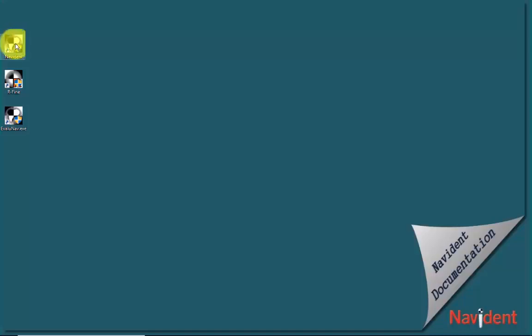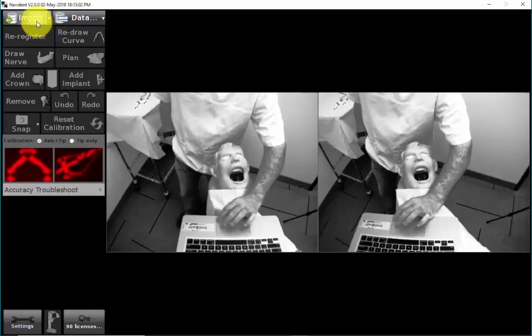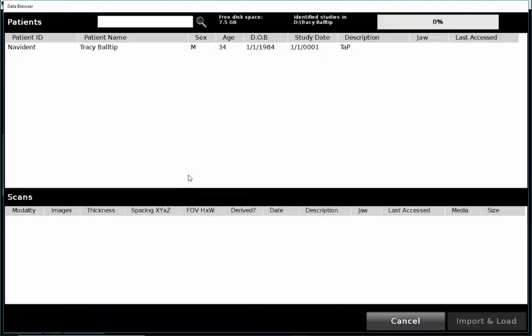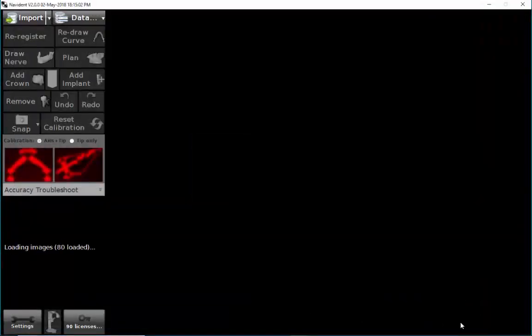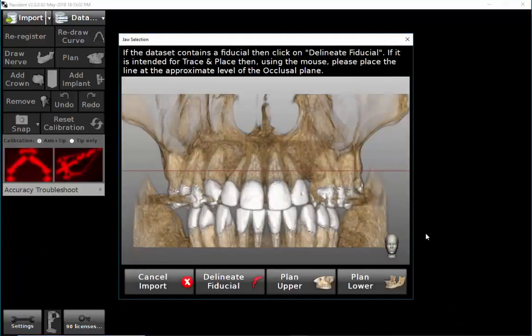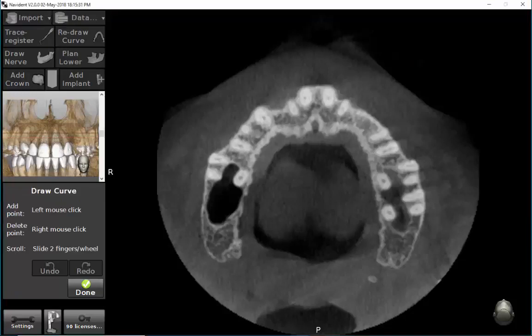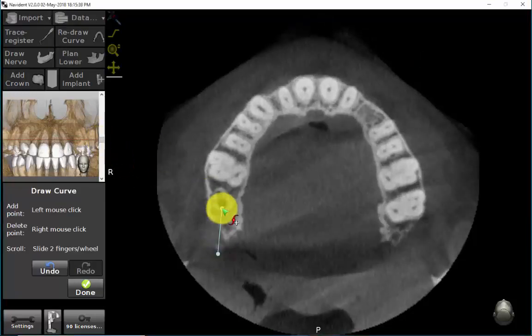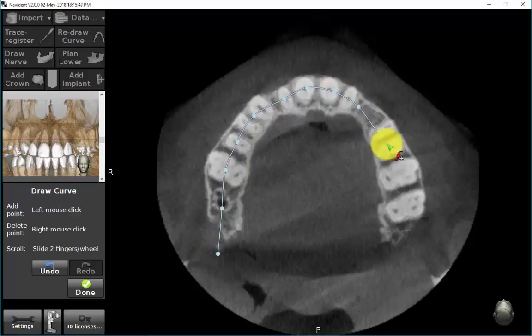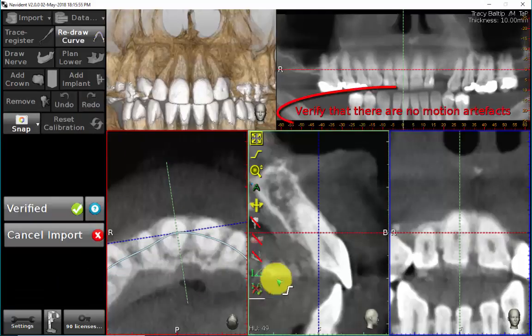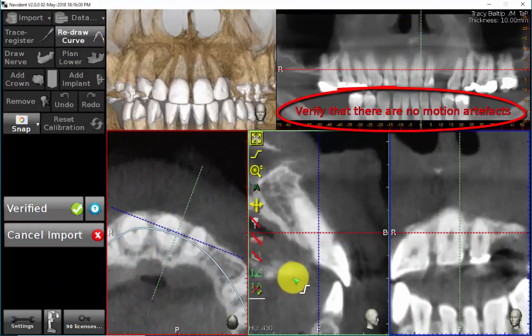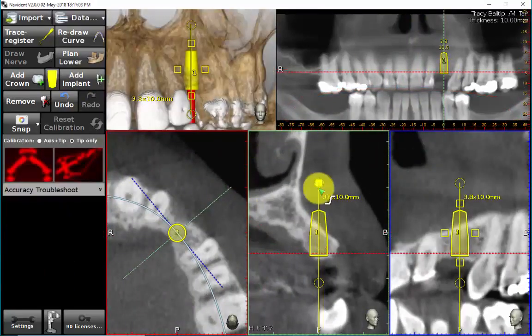Navident is started and the patient CBCT scan is imported as usual. Since the scan has no fiducial in it, I need to tell Navident which jaw I'm going to be working on and its location on the scan. To do so, I first drag the red line to the level of the occlusal plane approximately, then I select the button indicating the upper jaw. I manually mark the jaw centerline curve, usually at the level of mid-root. This curve is required for the generation of the panoramic view. Next, I scroll through the scan to look for any motion artifacts which, if present, can result in inaccurate navigation.